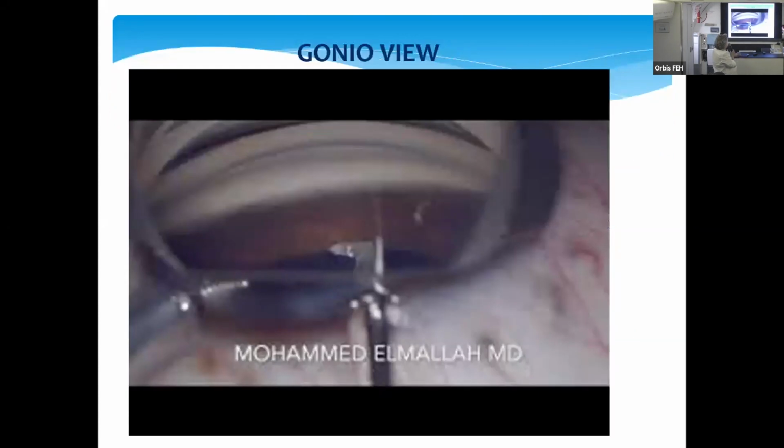Oh, this came out blurry. This is a slide. It's supposed to be showing you how you see the instrument near the angle, right? So when I do these, I have my wound. I put my gonioscopic lens on the eye after I have my instrument, my Trabectome, my KDB blade, close to the angle. I do the same thing in babies. Then I put on my gonio lens and finish going all the way to the TM and so forth. But this came out blurrier than I thought it would.